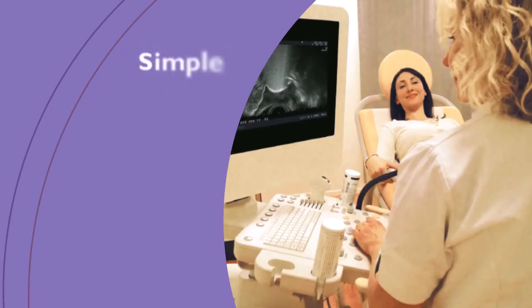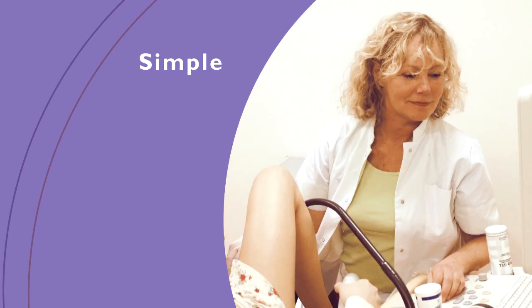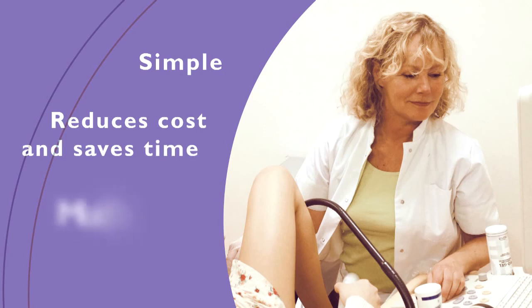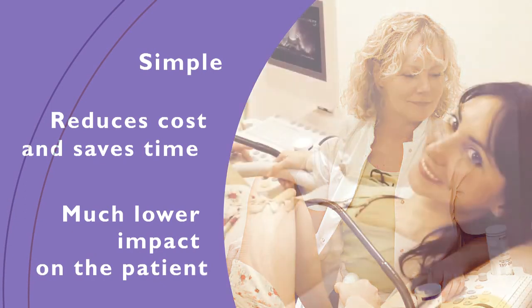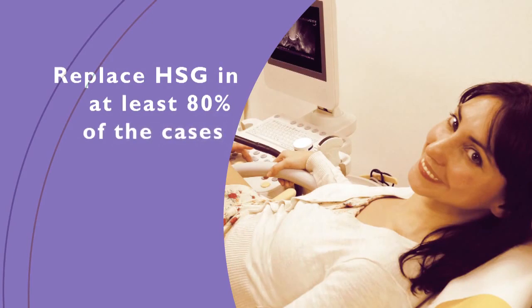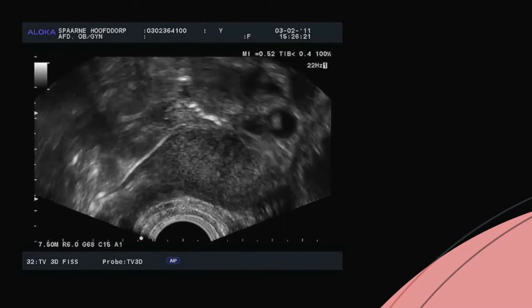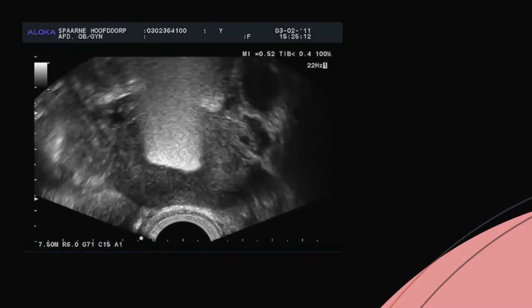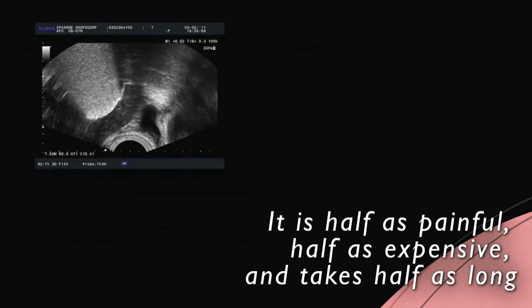The advantages for doctor and patient are clear. Patients can now be examined at the familiar outpatient gynecology clinic. Neither the gynecologist nor the patient have to go to radiology, saving time and money. Moreover, this examination is very patient-friendly and causes relatively little discomfort. This new method can replace painful HSG in at least 80% of cases. In addition, this simple examination makes it possible to assess tubal patency in an early phase of the fertility assessment. The Academic Center of the FU University in Amsterdam conducted research on the XM Foam Kit and concluded that it is half as painful, half as expensive, and takes half as long.